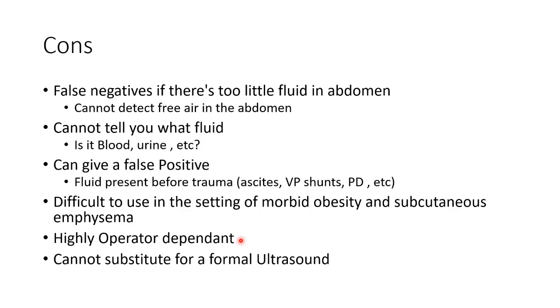By all means, do an ultrasound. And if you pick up something, mention it, but also mention your experience level during your transfer. I'll give you an example. I've picked up many ectopics in the A&E, very early ectopics, but I've let them know that this is my experience level.